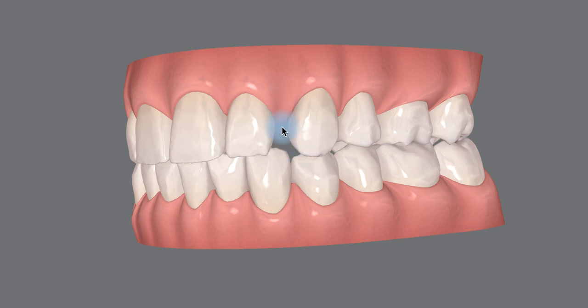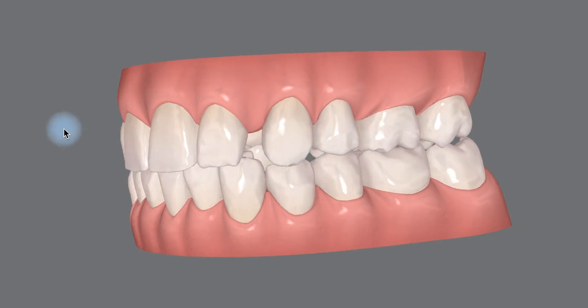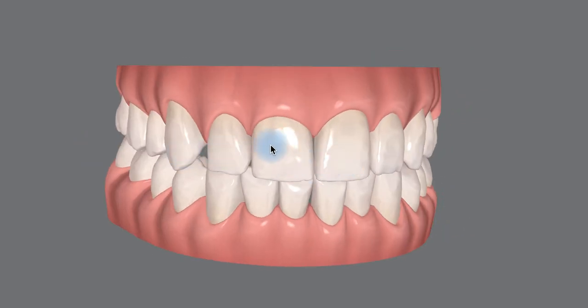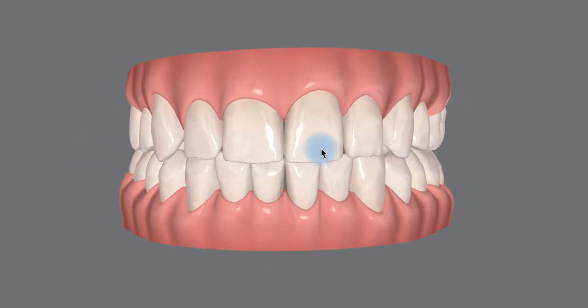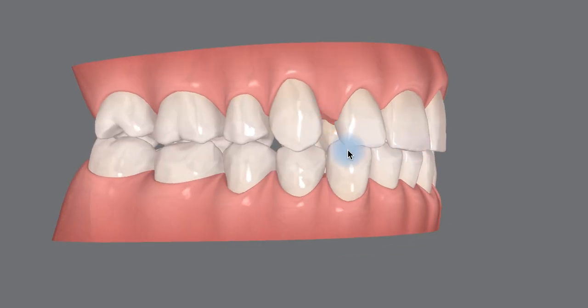One option is behind the laterals. Another option is to put it behind the canine. Another option is to actually spread it out across all of the front teeth and then use veneers to restore the teeth accordingly. Honestly, I think what we do is we actually get you here just to get your jaw closed first, and then we can have the conversation about what it would look like if we did veneers or just left the space there or left the space here. There's several different options that could get us to the finish line.